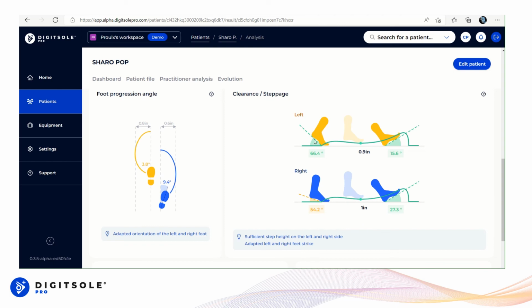And then we see the angulation at toe off and the attack angle at heel strike. So at toe off, there should be an angle of plantar flexion, which means that they are using the strategy of using plantar flexion, and we see that they're on the high end of normal here. And then we have the attack angle, which is going to be the heel strike, right? So that's the angle of the foot relative to the horizontal or the surface of the ground.